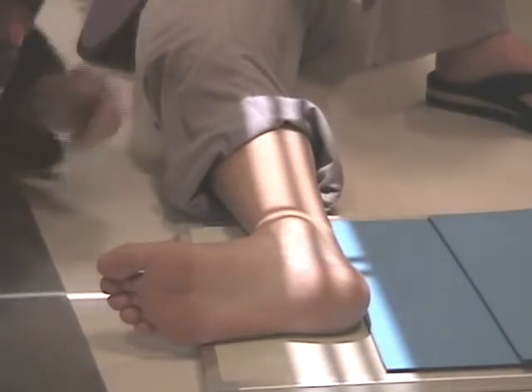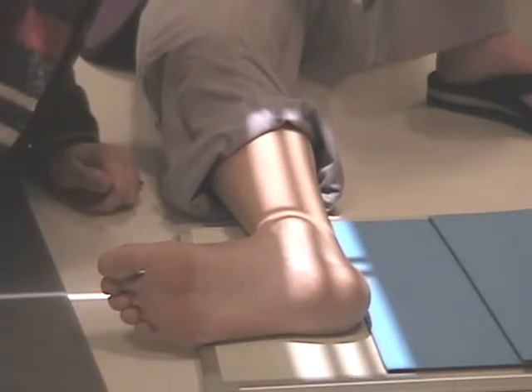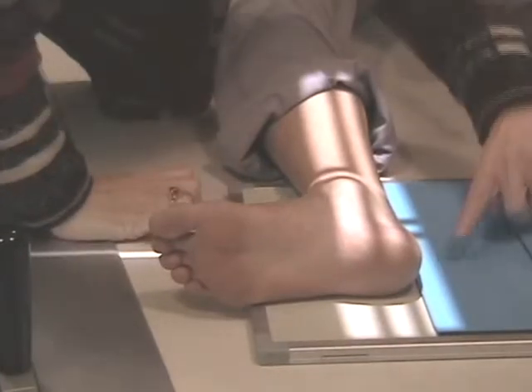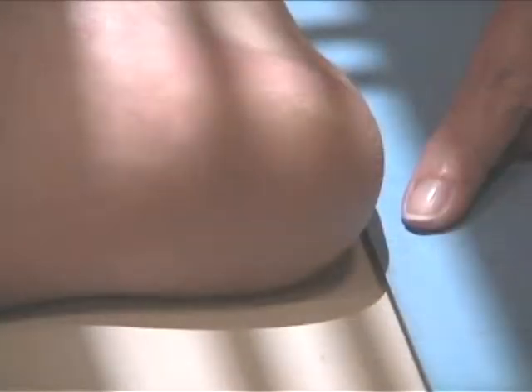So now I'm just making believe, guys, just so I can teach you a principle. This is not good centering, but it's to teach you a principle. See how I have a little bit of the ankle soft tissue over that lead strip?